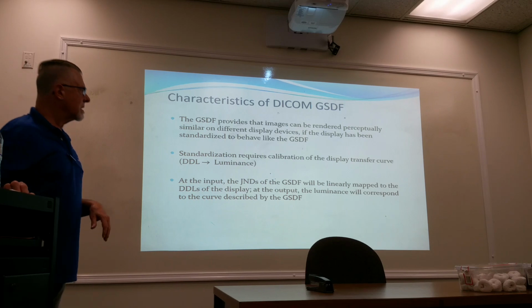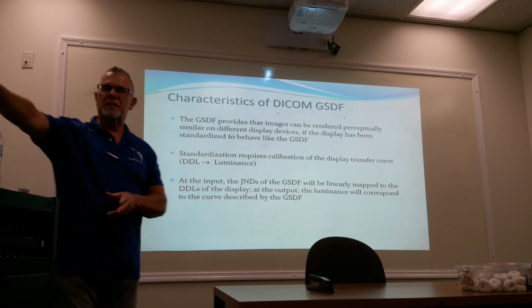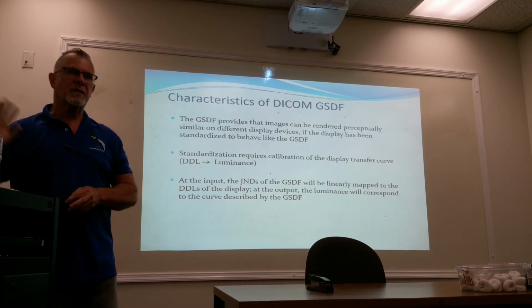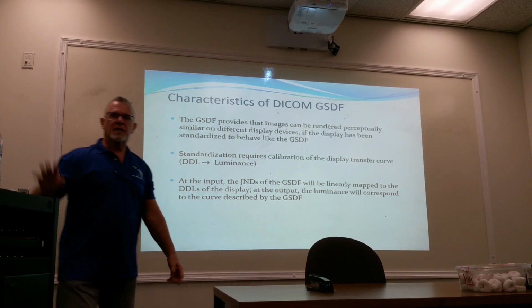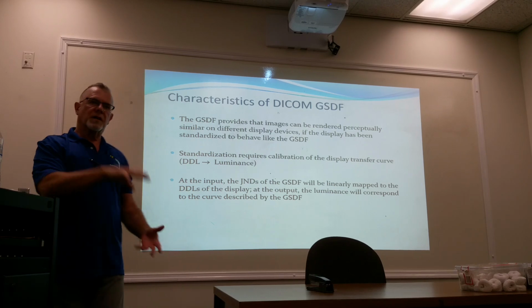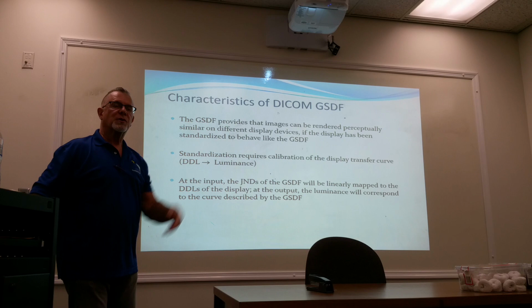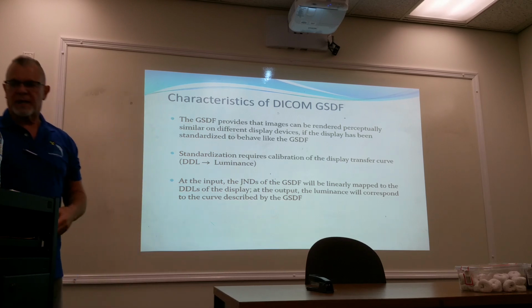It's especially important in ultrasound. Ultrasound is one of those things where, as you're doing the procedure, the tech is changing the display, the contrast and the brightness, to get an image that looks good. The problem is then they print it and it doesn't look like that, because they're changing the display and not how the unit is sending to the display and ultimately the printer. So it's a standardization way.